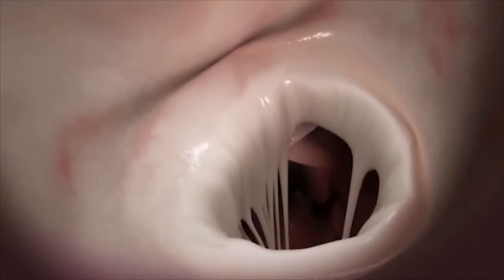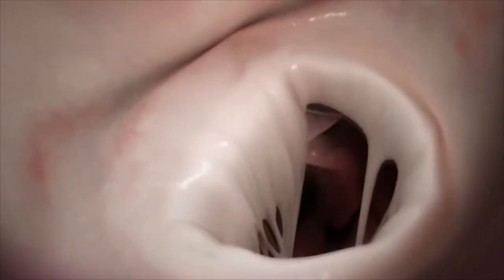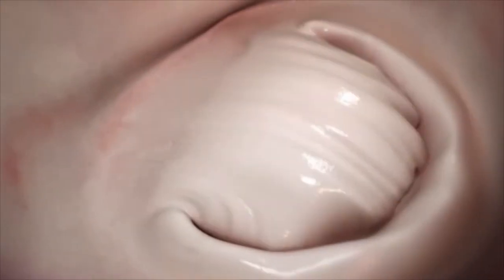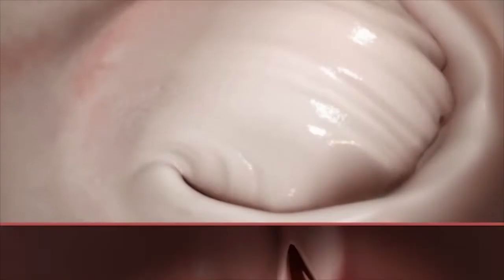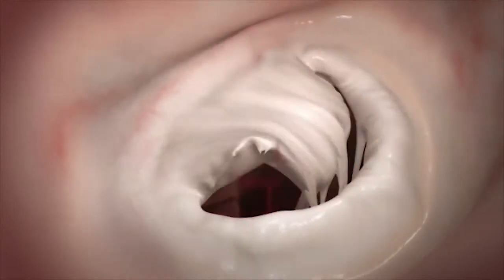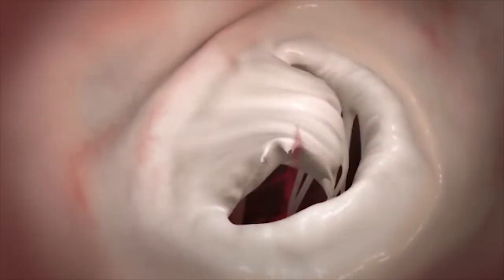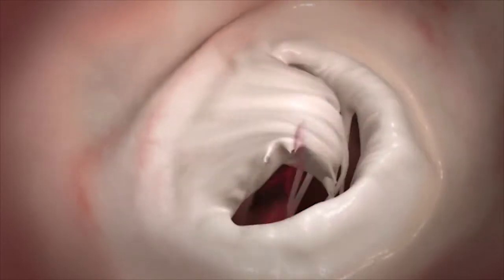The leaflets of the mitral valve are attached to the papillary muscles inside the left ventricle with cordy tendons, whose function it is to hold the leaflets in place during systole. Ruptured or elongated cords caused by valve disease may lead to a situation where the leaflet coaptation is compromised. This causes mitral valve regurgitation, or MR, where blood leaks backwards across the valve.